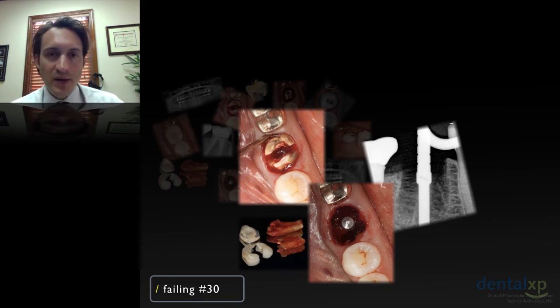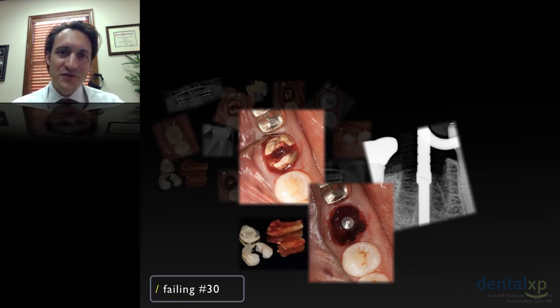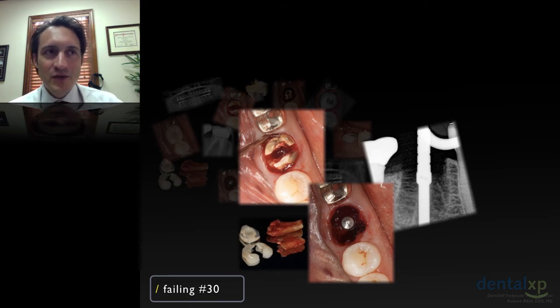And you can see I'm using a periotome. Again, I'm a firm believer in customization of my instruments. I feel like all of us have different ways that we practice. We have the instrument, but the way that we use them may differ, and customization of those instruments is important to me. So I'll customize the periotome in this case.